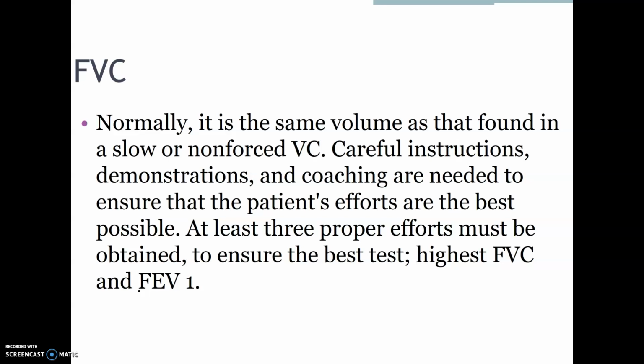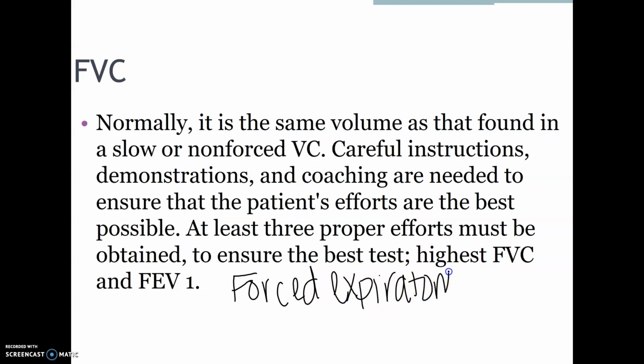And the highest forced vital capacity and FEV1, which is forced expiratory volume in 1 second, is recorded. This is going to be an important part of the PFT when we start looking at determining if the patient has an obstructive component or if they have a restrictive lung disease.